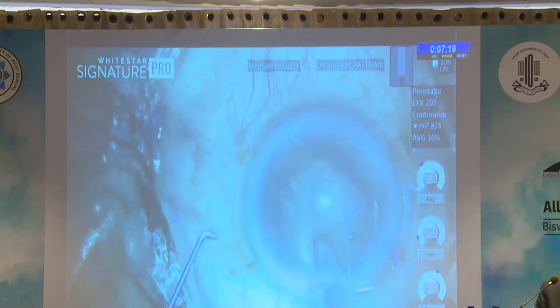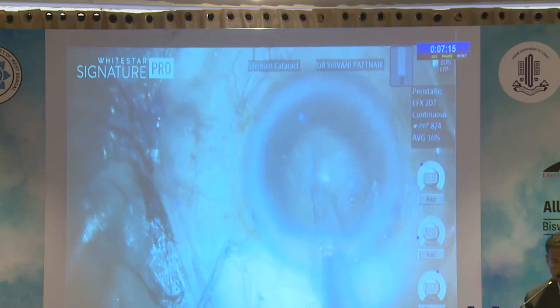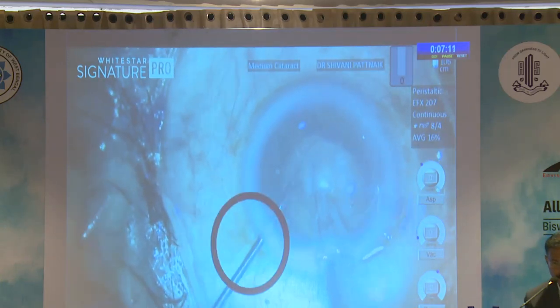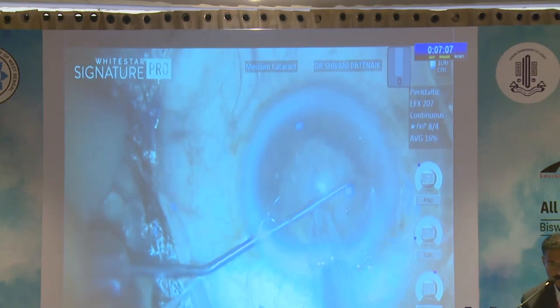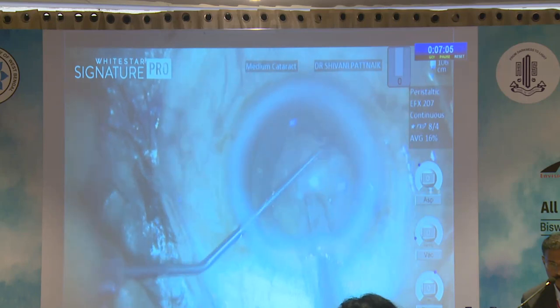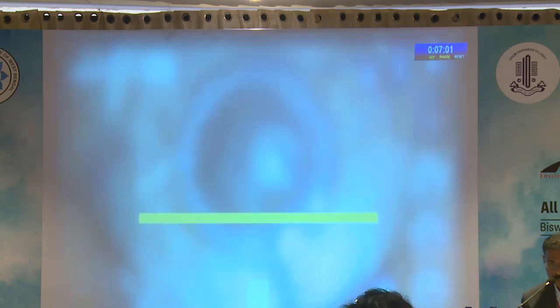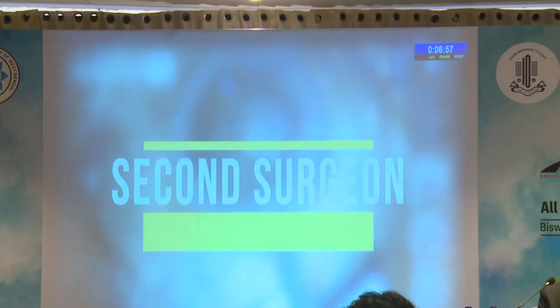Let's see, the trenching is going on. The trench is not deep enough. The trenching is derived from the common technique that we used here. We can see that the side port is leaking because a large side port was created. That itself causes the chamber to become unstable. At this point, when we rotate, we are also breaking the walls of an already soft cataract. A crater is formed and the second surgeon takes over.